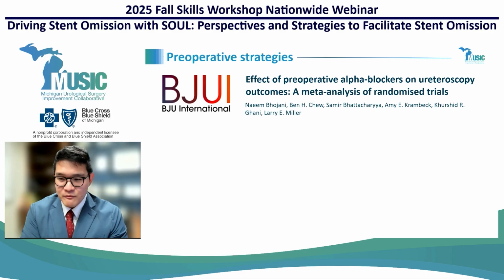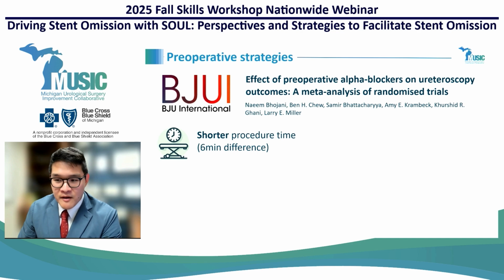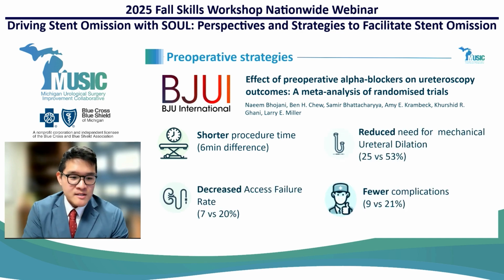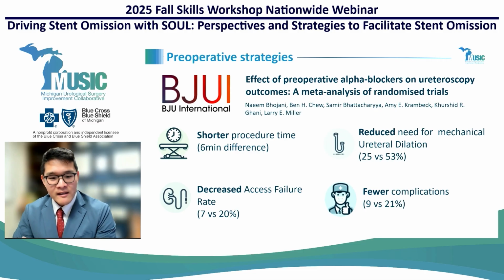I think other things that have really helped is really trying to optimize people beforehand. And so this is a nice review paper on the benefits of alpha blockers before ureteroscopy. And it really showed that there's decreased negative ureteroscopies because you couldn't get the scope up and the need for dilation.